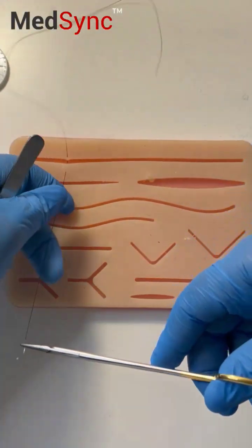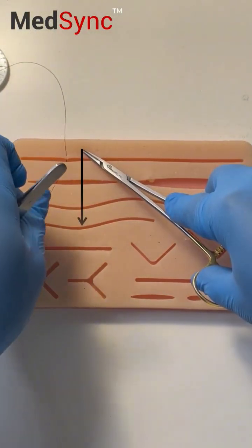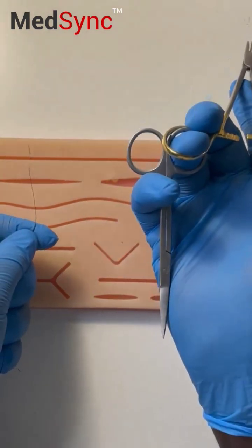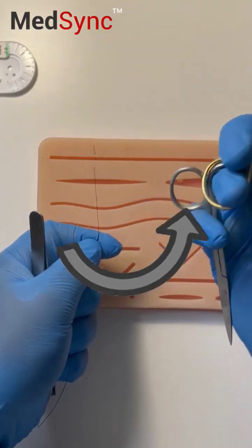Don't put them down. You grab the suture and you pull it in one hand. Your forceps are here, your needle holder is here, and your scissors are here. This is economy of movement.